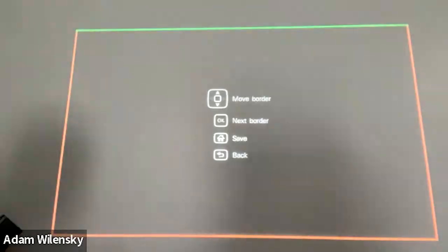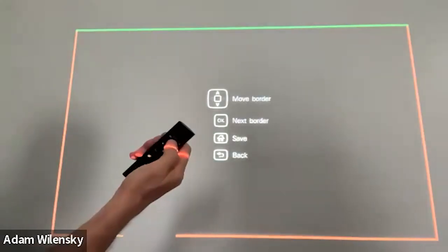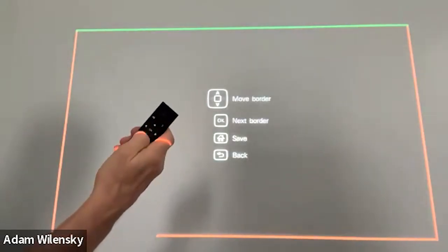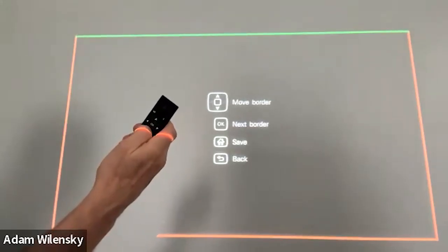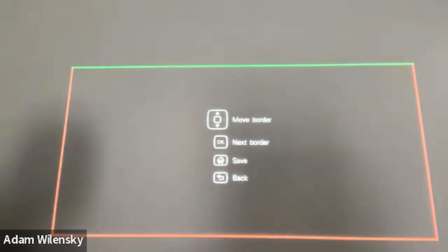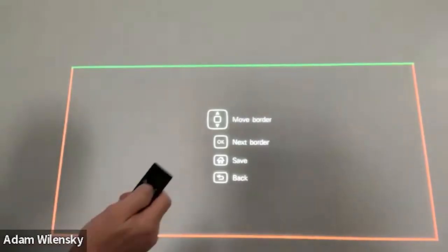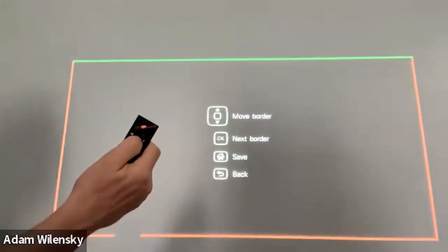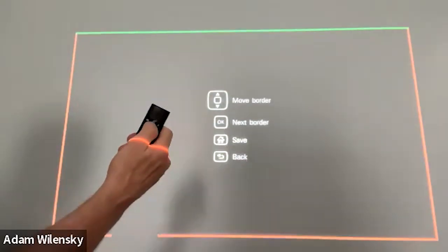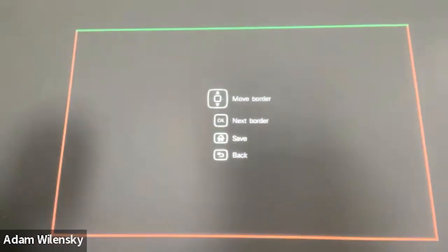That's my border. I'm just going to take my remote. I'm going to click up. And I pretty much reached the apex of that area, but can reduce it. So in this instance, think of the Tover's projection space as being impacted by the height of the unit's installation. So the higher up the unit goes, the larger your playing canvas, and vice versa.